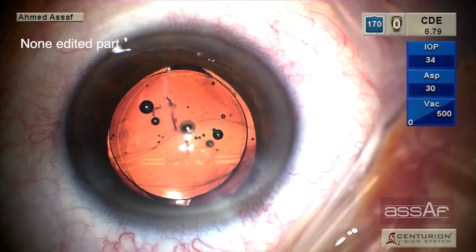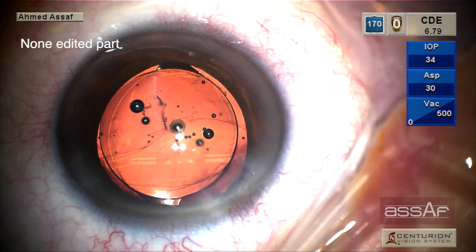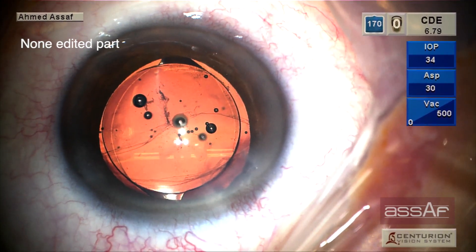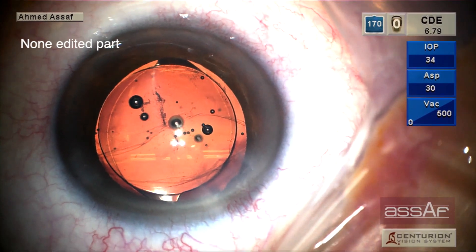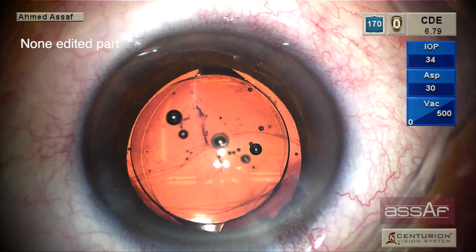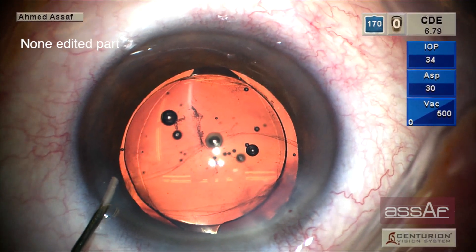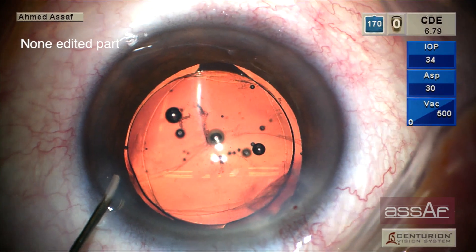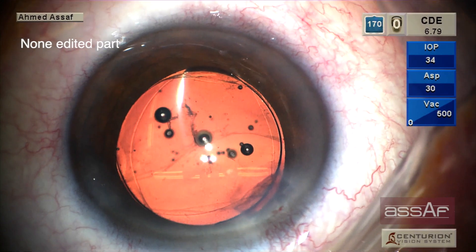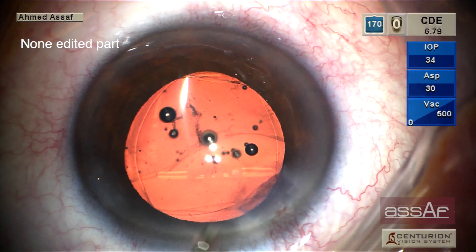As you can see, the lens is very well centered, and after irrigation-aspiration, we can add extra stability of the lens by bringing the pupil down via injection of acetylcholine inside the anterior chamber. Bringing the pupil down also confirms the absence of vitreous inside the anterior chamber by the roundness of the pupil.